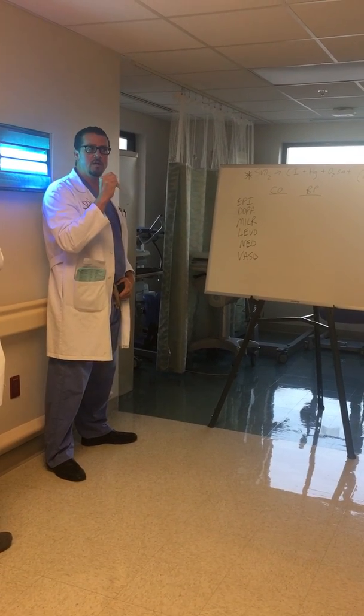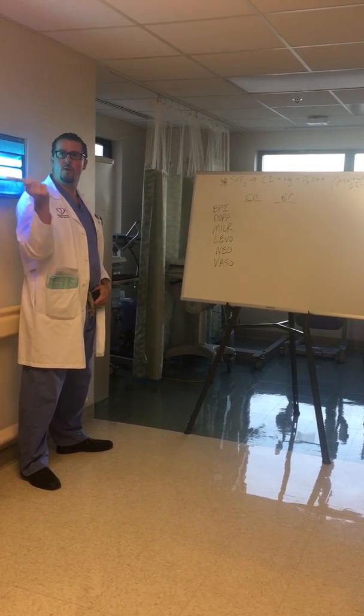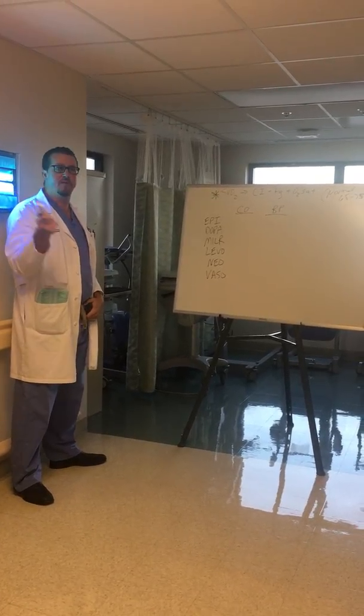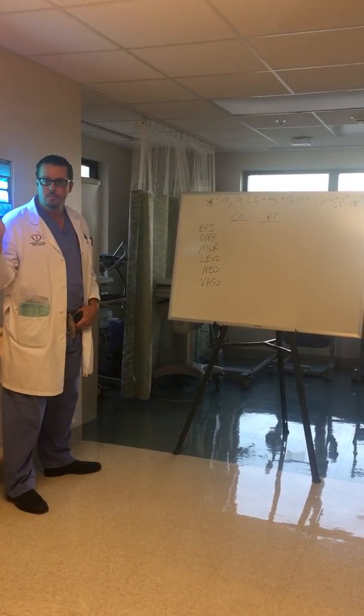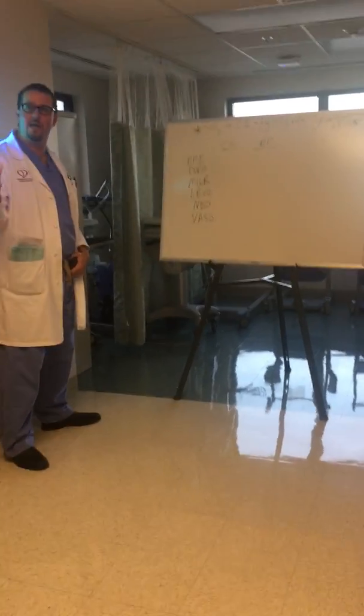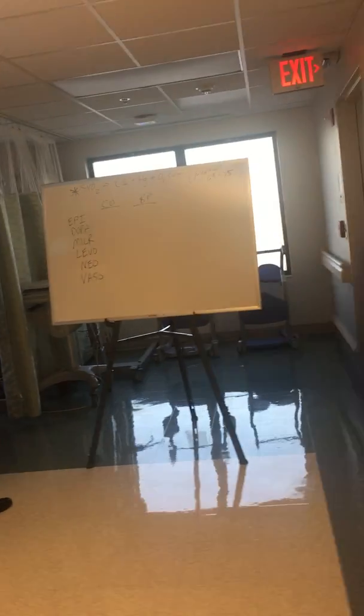Left? It should be green. What does it mean? What's SQI mean? Swan quality index. So if it's reading 4, you need to shoot an X-ray, call the intensivist, and figure out what's wrong with the Swan. It might not be in good position, might need to be flushed, recalibrated, whatever. You know what I mean?